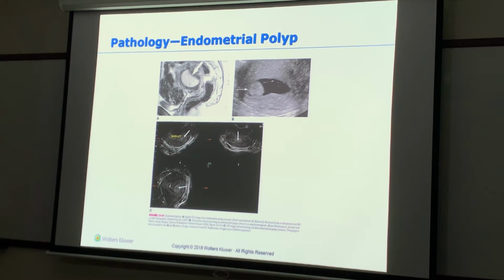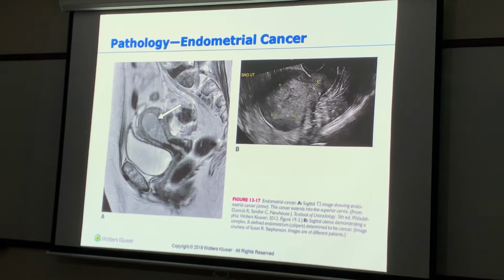They don't teach that to you in the books. You have to know it clinically. Okay? So after we see the smaller triangle inside the endometrium, I'm going to zoom that image, and I'm going to look at that endometrium as slowly and as meticulously as I can, because something's there.